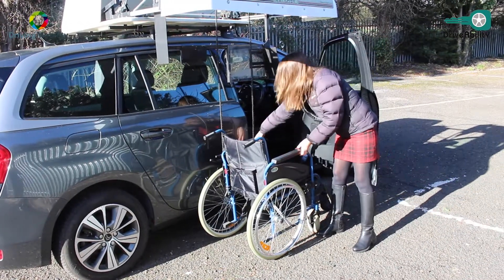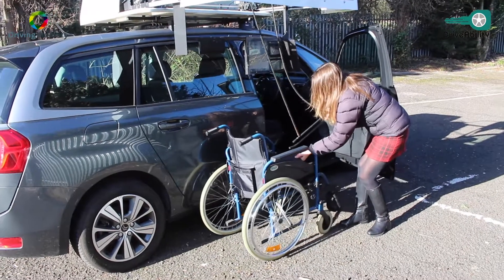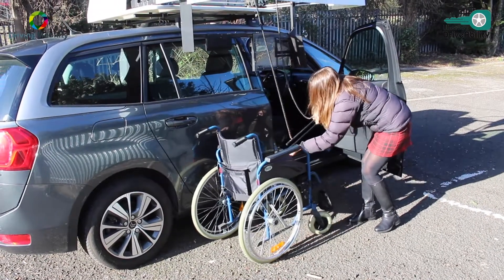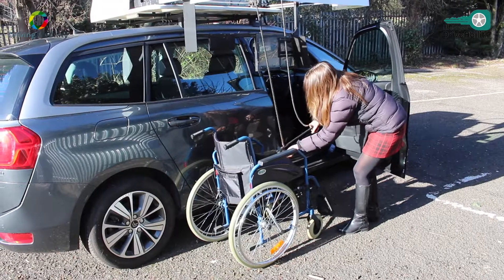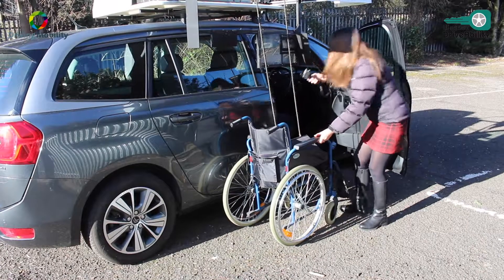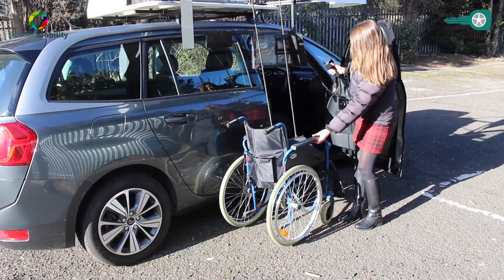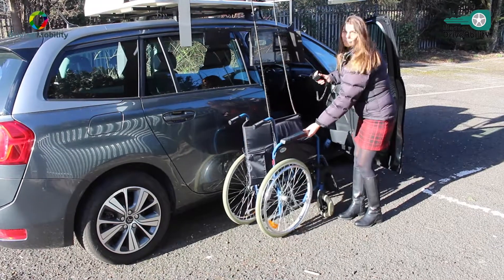So stowing it in reverse — that's a simple procedure as well. We just put the wheelchair onto the bar there, all on the buttons, all on remote control. And does that fold? Oh, I see — it folds the wheelchair up.